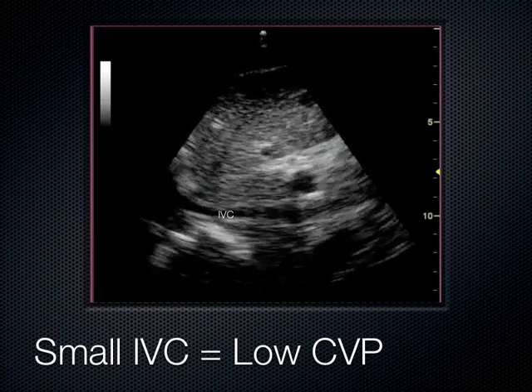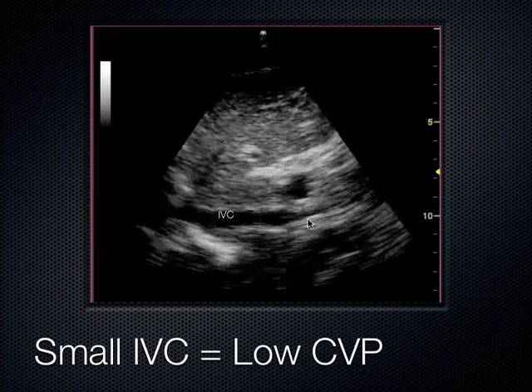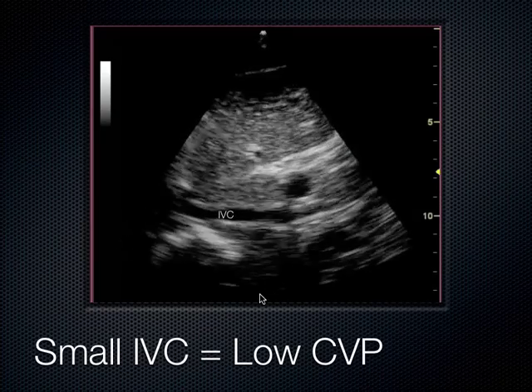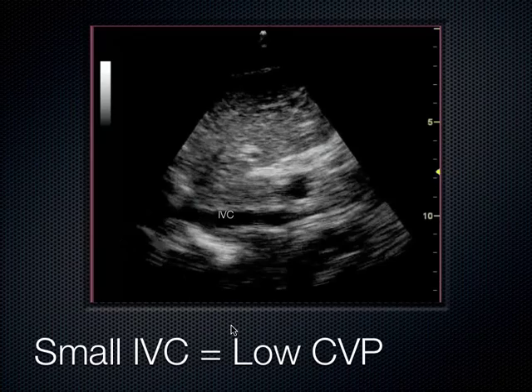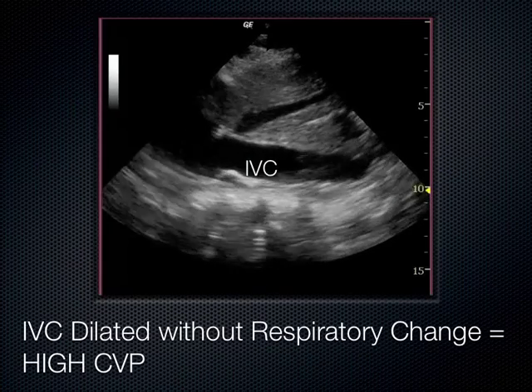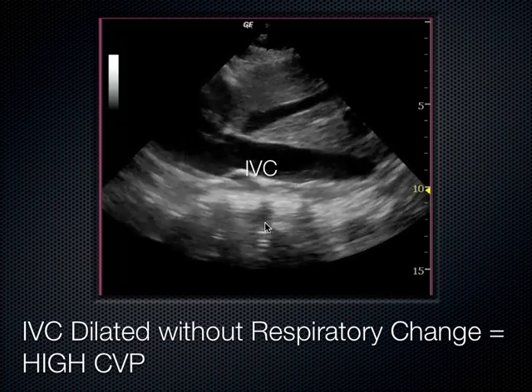Here's one that's a really small IVC that as they breathe in, it sort of collapses down. And we can see this collapsibility here going on. As they breathe in, it just completely obliterates. So that's a really low CVP. This is somebody where I'm like opening up the IV fluids on. Another example here of a dilated IVC, no respiratory change, high central venous pressure.